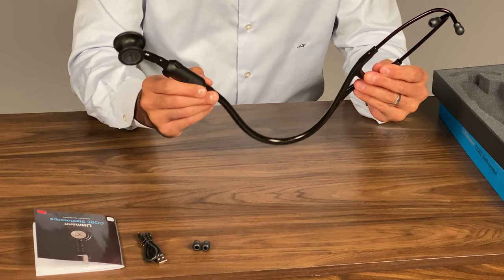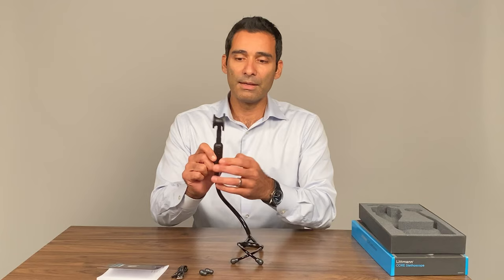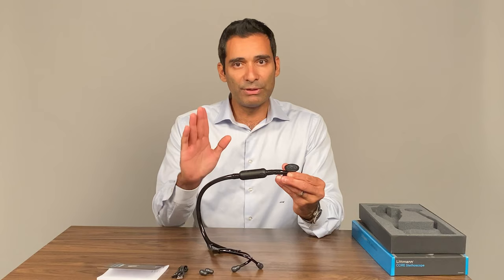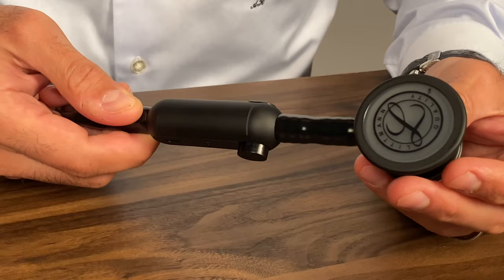The tubing is what we're used to from the cardiology grade lines from Littmann. The core attachment is low profile, doesn't add a lot of weight, and it's pretty seamless — not even that noticeable. It has a dual-sided chest piece with a clean matte finish and the diaphragm is tunable.